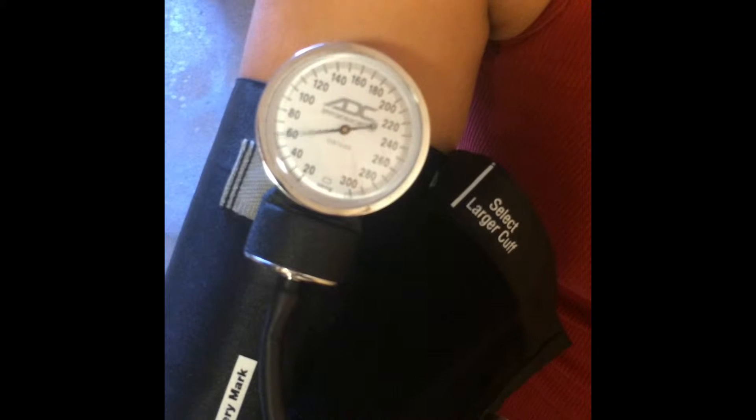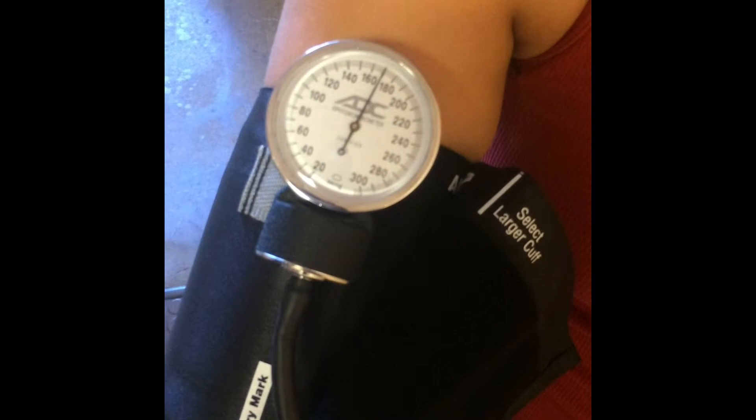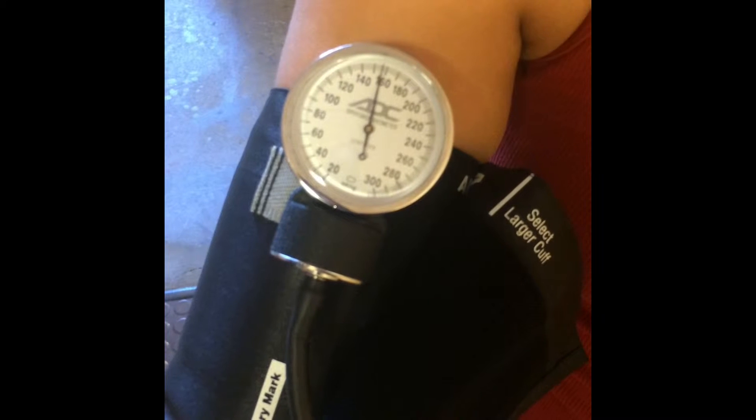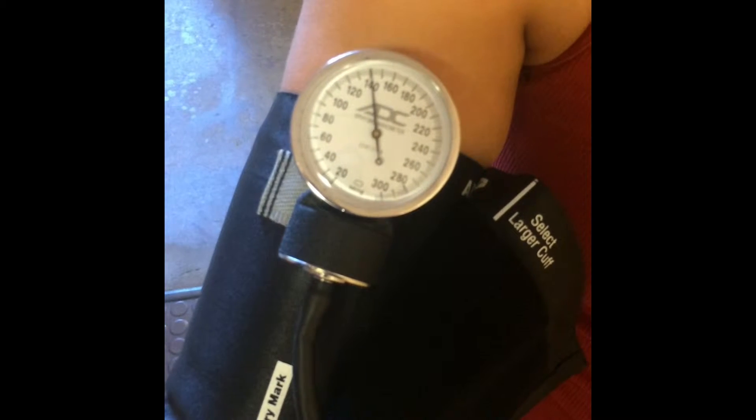Now you will need to put the pressure up to 180 millimeters of mercury. Then release at a rate of 2 to 5 millimeters of mercury per second. That way you are able to hear the Korotkoff sounds at around 120 to 80 millimeters of mercury.